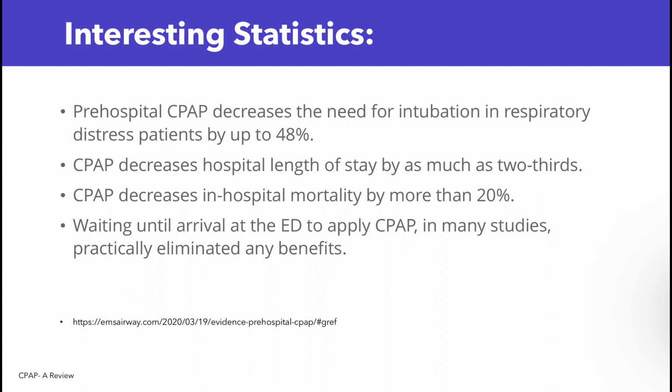Pre-hospital CPAP decreases the need for intubation in respiratory distress patients by up to 48%. CPAP decreases hospital length of stay by as much as 2/3. CPAP decreases in-hospital mortality by more than 20%. Waiting until arrival at the ED to apply CPAP in many studies practically eliminated any benefits.